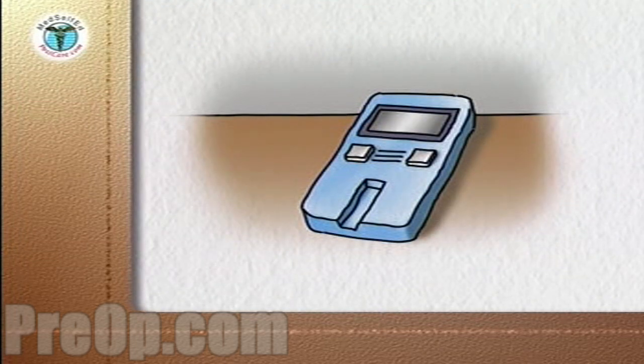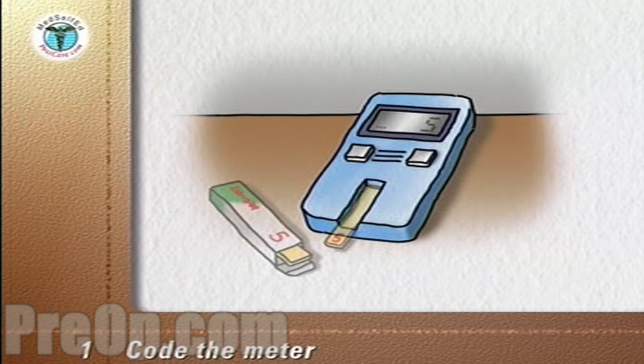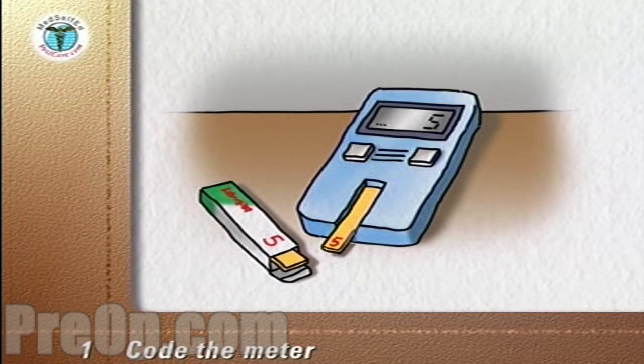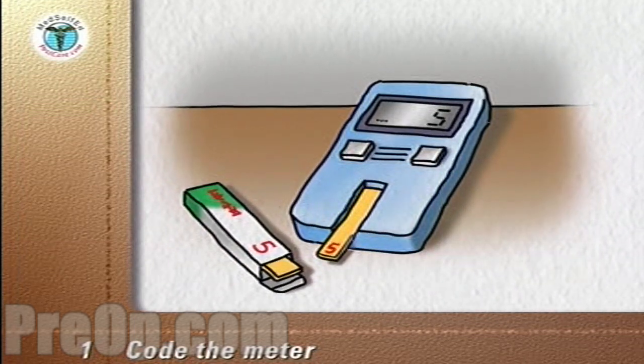The first step is to code the meter — to match or calibrate the meter to the reactivity of the test strip. This is done by following the manufacturer's instructions and matching a number on the meter's display to a number on the code strip or on the test strip package.